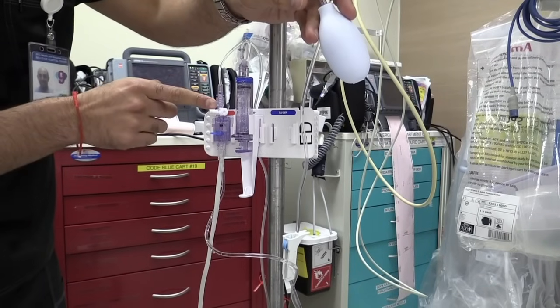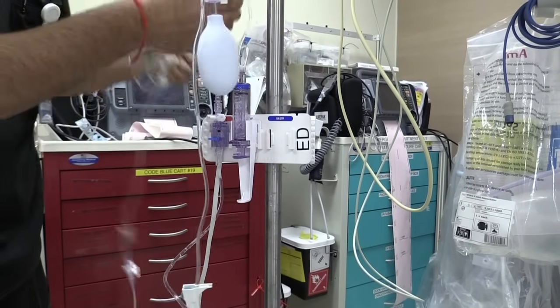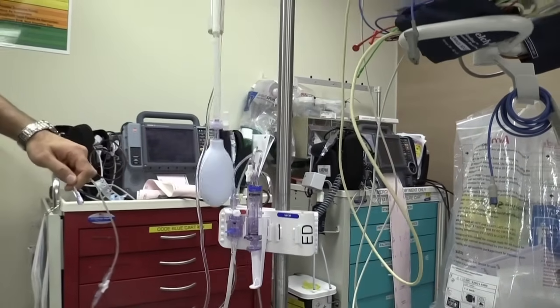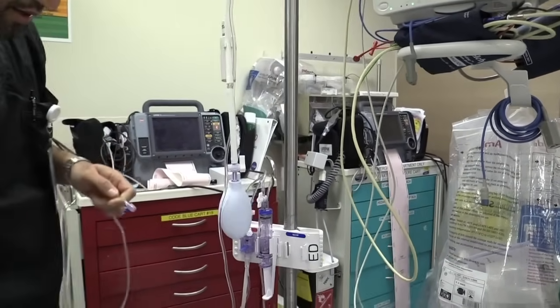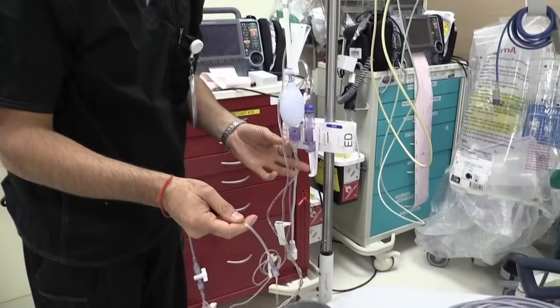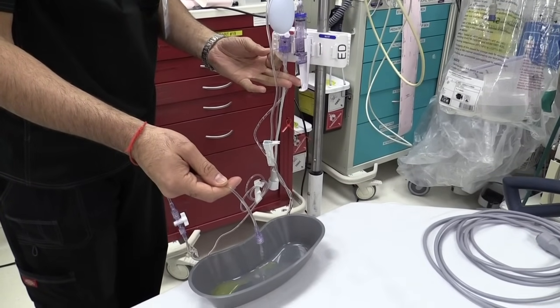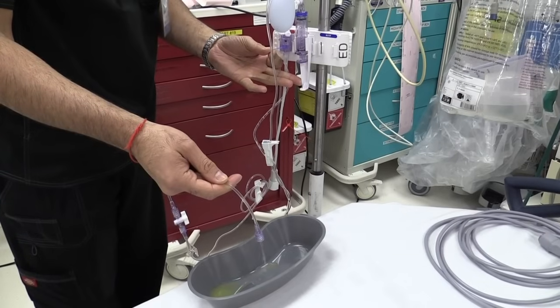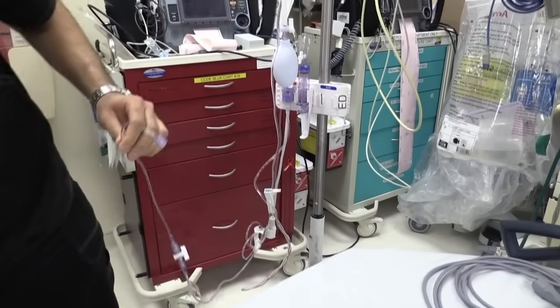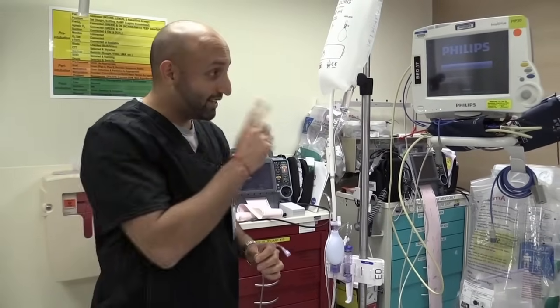As soon as all the bubbles are out of the IV tubing, you're done with that portion and you're going to lock it in that direction. Now we're going to take out all the air from here all the way towards the end of the IV tubing that goes towards the patient. We'll get a little basin to make sure we're clean on this part, pull on the tab, and make sure that IV tubing is clear of any and all air bubbles. And as soon as that's done, we are done. All air bubbles are out and now we're ready to connect it to our monitor.